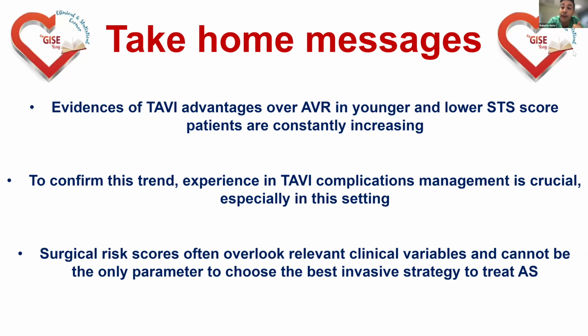That's why we have to be perfect in our practice. And so we need to learn how to deal also with this type of complications that could happen without using cruent and without asking our surgeon to intervene, which is something that could happen, but it's better if we can avoid it, especially for the patient.